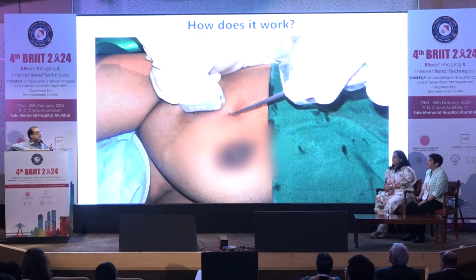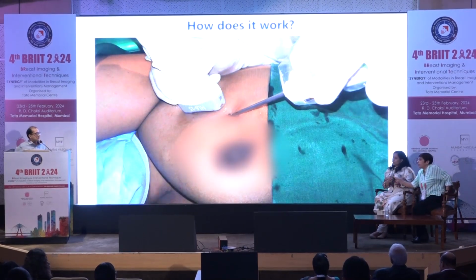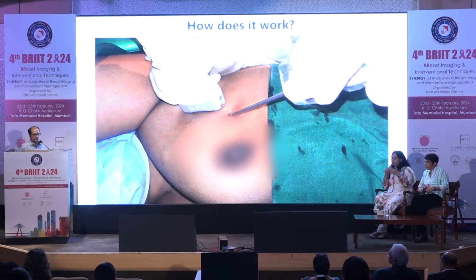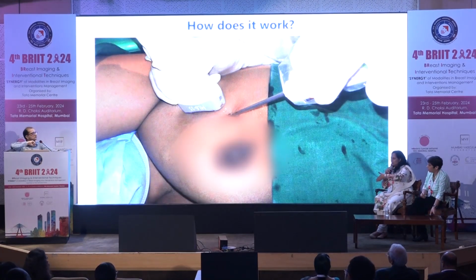So maybe 1 or 2 centimeters depending on where the lesion is located and where your incision would be. She's telling to try it with the spinal needle first, and you will need at least more than 3 centimeters when the lesion is posterior. It comes out of practice, we really don't have to measure, but you have to remember this step so that you don't make a second incision or struggle. Many times we try to manipulate the needle with the first skin incision made, and we struggle throughout the procedure. Instead, we have to realize that we made a wrong marking in the skin and then move further and make a second incision.